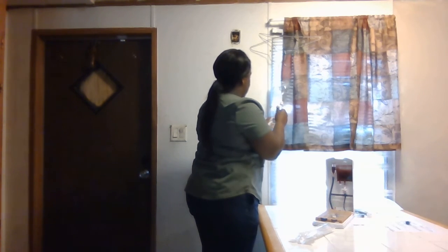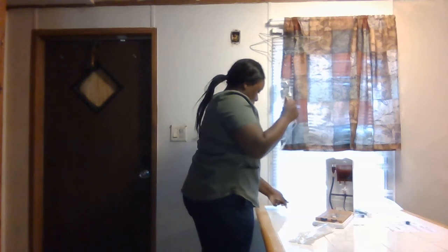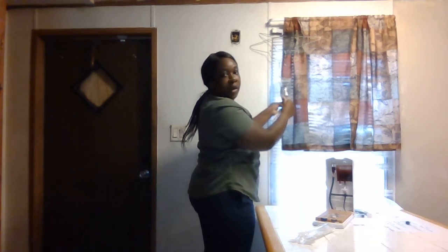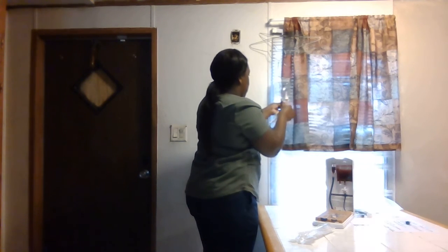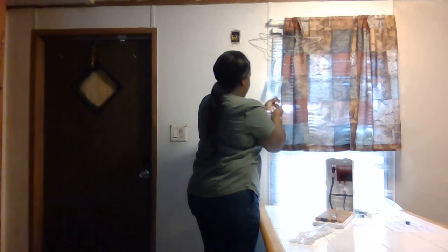Okay, so I'm going to take this off again, maintaining sterility, and for home purposes I'm going to have to hold this because I don't want my hanger to break. But again, I know to be sterile with this and spiking it. And then I'm going to spike it, twist, push, twist, push, twist, push, twist, push.